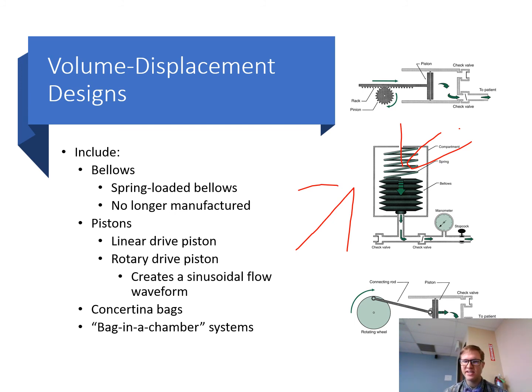When we're looking at these linear devices, these use an electrical motor that is connected by a special gearing mechanism or a piston, a rod, or arm, and that's what you're seeing in these other devices up here. And you'll see those pictures in your reading material as well.